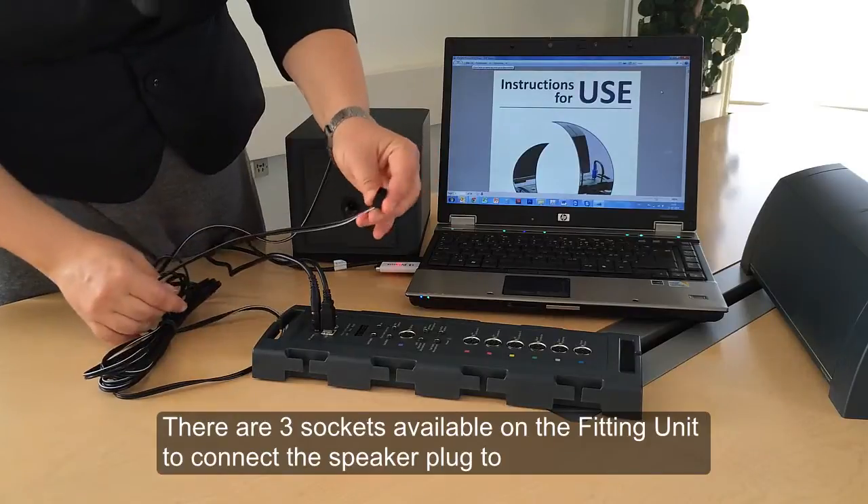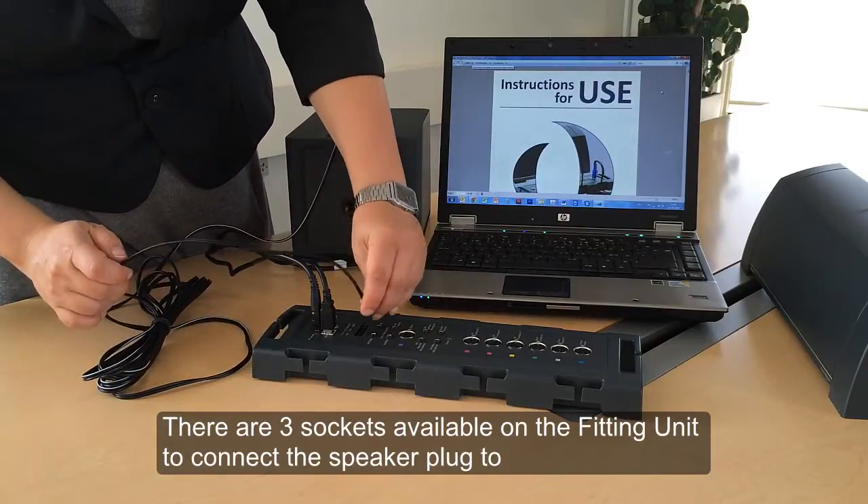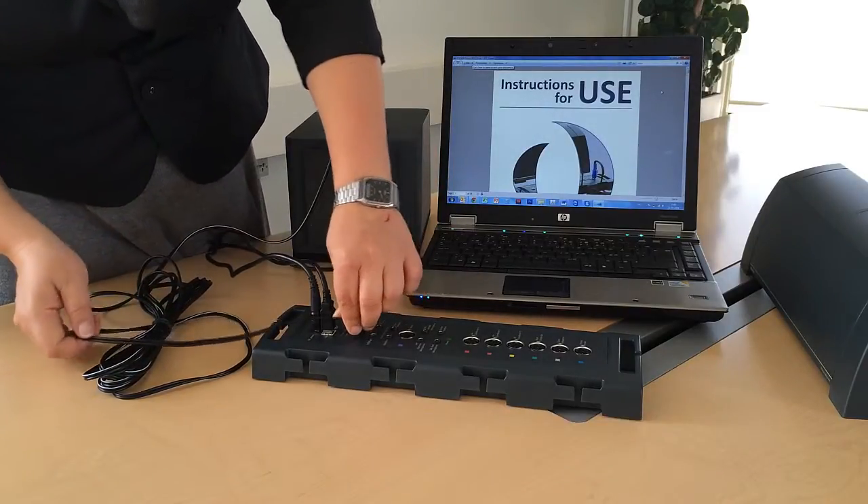The speaker cable can be plugged into any of the three speaker inlets for up to three field speakers on the fitting unit.